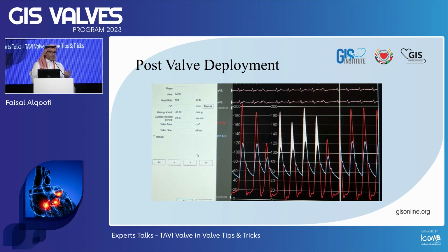So despite post dilatation, this is the result we got with post dilatation for a 23 millimeter valve. Would you leave this or would you think about doing some fracturing of the valve? So Hussein says fracture. Okay. I will fracture the valve.